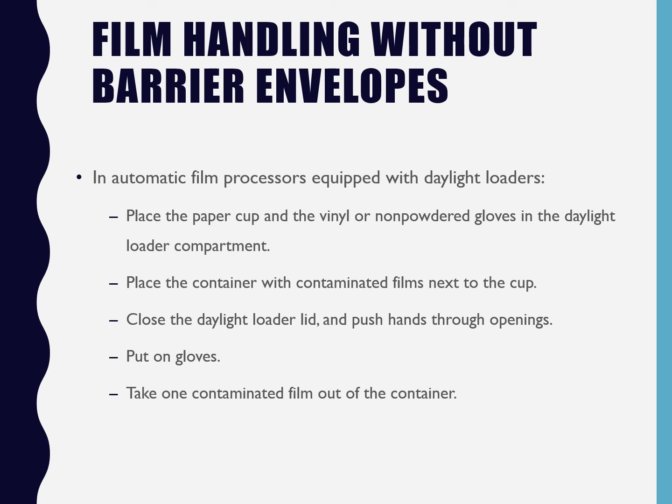I think that it's a good idea just to have it there. That way, once you open, you can wipe everything down. And then for our purpose of this, you already have gloves on and you put a pair of gloves in there to change into. But before, when you're not at an educational institution, you do trust that everyone is doing the daylight loader process properly. And so you go in with bare hands, you come out with bare hands.